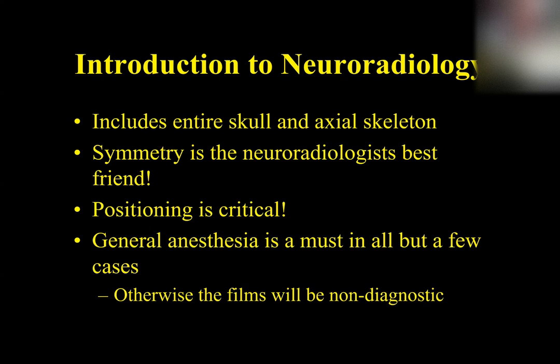The other thing to keep in mind, because positioning is critical, especially when you're talking about neuroradiology, is that for the most part, anytime you're shooting films for a neurologic type case, general anesthesia is going to be a necessity. There's very few dogs you're going to be able to lie on their back, stretch their neck out, and get good quality films without the aid of general anesthesia. So gas anesthesia is typically the best.